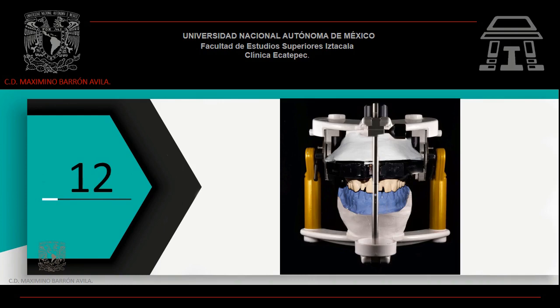Coloca nuevamente la platina de montaje en el articulador semi-ajustable. Coloca el sistema ACUTRAC ya sin el espaciador. Monta tu modelo inferior a través de un registro de relación céntrica.